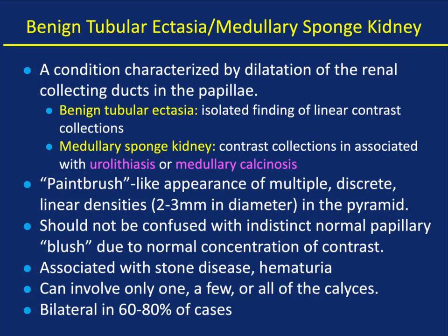Benign tubular ectasia and medullary sponge kidney is a condition characterized by dilatation of the renal collecting ducts in the papilla. With benign tubular ectasia, it's an isolated finding of linear contrast collections. With medullary sponge kidney, it's contrast collections in association with urolithiasis or medullary calcinosis — so for medullary sponge kidney, think stone disease. The paintbrush-like appearance of multiple discrete linear densities in the pyramid is classic. It should not be confused with the indistinct normal papillary blush due to normal concentration of contrast. It's associated with stone disease and hematuria, and can involve one or all calyces and one or both kidneys — it's bilateral in 60 to 80 percent of cases.